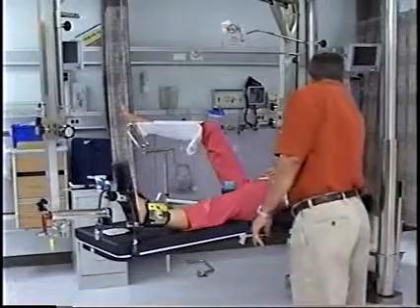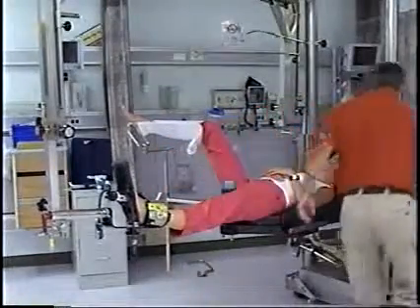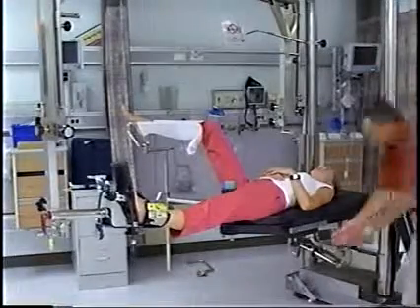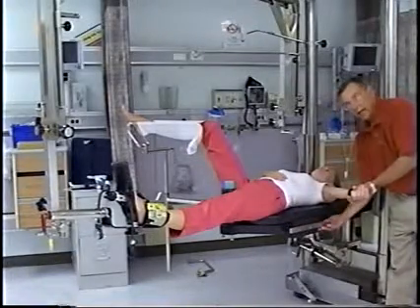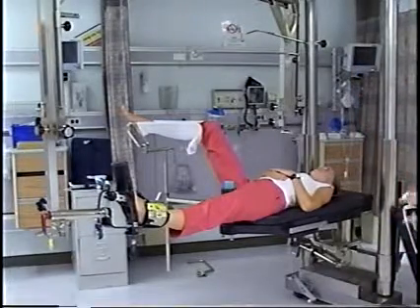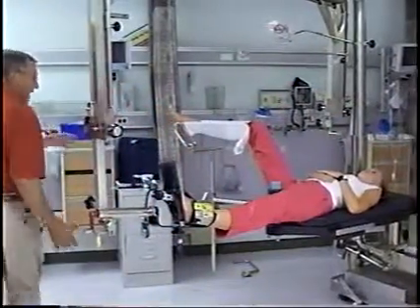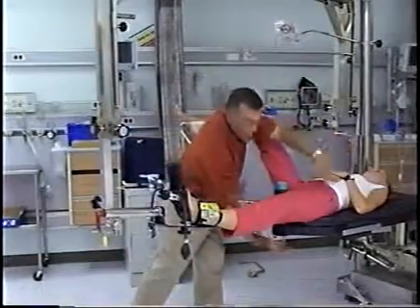Once that's there, you okay? Mm-hmm. Okay, once that's there, this comes out and is set aside. Okay? We would attach an arm board here, okay, for anesthesia. But now she's suspended there, and the doc is going to come in. The C-arm is going to come in from the unaffected side, and take a shot of the hip.